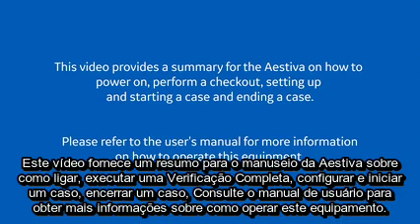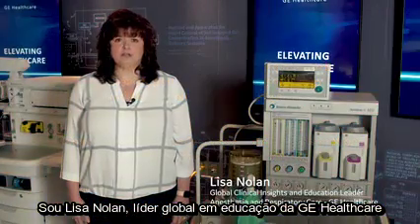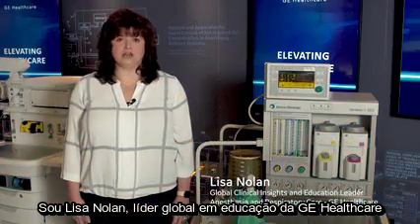This video provides a summary for the Aestiva on how to power on, perform a checkout, set up and start a case, and end a case. Please refer to the user's manual for more information on how to operate this equipment. I'm Lisa Nolan, Global Education Leader with GE Healthcare.